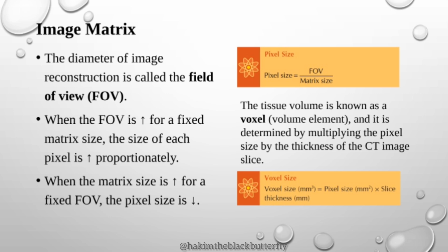When the field of view is increased for a fixed matrix, the size of each pixel is going to also increase. That deteriorates image quality.